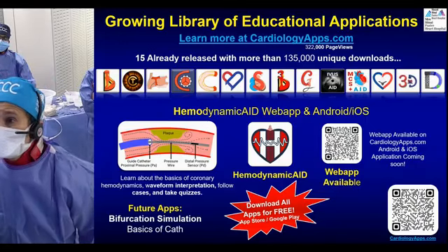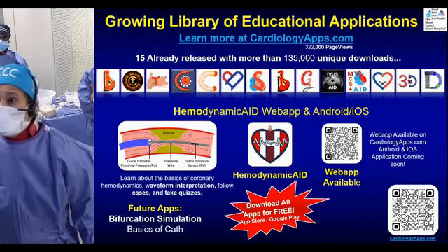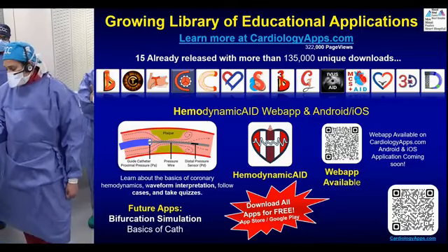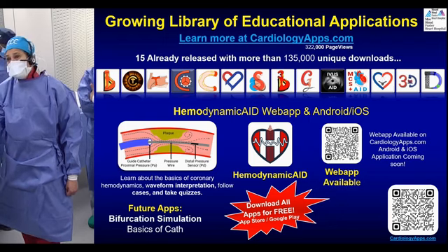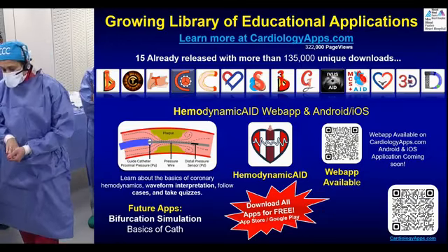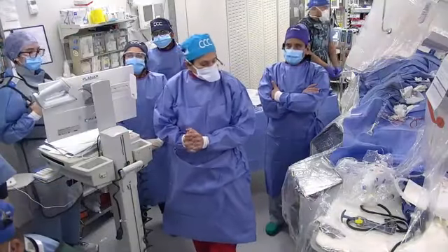Someone put in the chat: no post dilatation for certain segments. You've seen the final IVUS, well apposed. So the question comes that we did not post dilate, which is a routine practice.